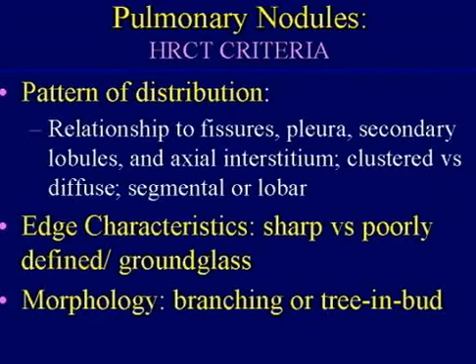What are the things you have to think about when you have someone who has diffuse nodules? Well, the first thing you have to decide is that, in fact, what you're looking at is a case with diffuse nodules, and I'm not being glib about that. It frequently is one of the most difficult things to do.